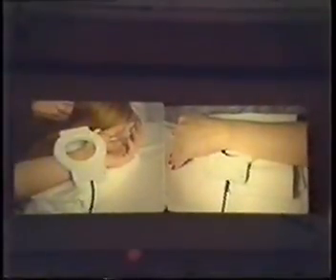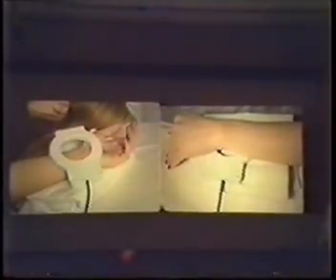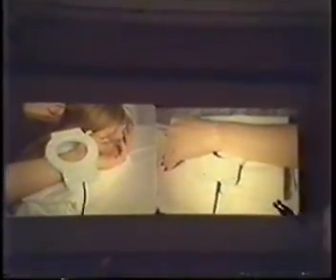You can have the arm up by the head or even down by the side with the anti-wraparound software, which a lot of GE systems have and others have as well. And both of these can be used. Generally, I found this one to be the best because there's still a little wraparound from the body and some motion artifact from the body, which will occasionally degrade images when they're at the side like this. But this works out well.